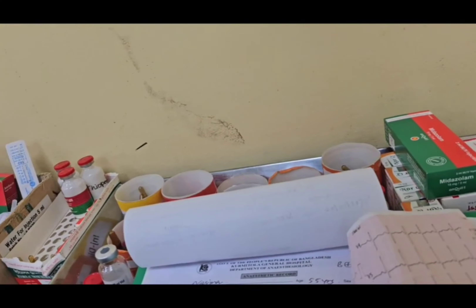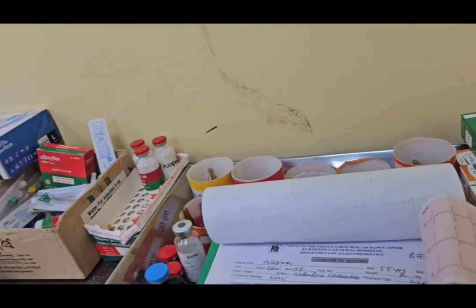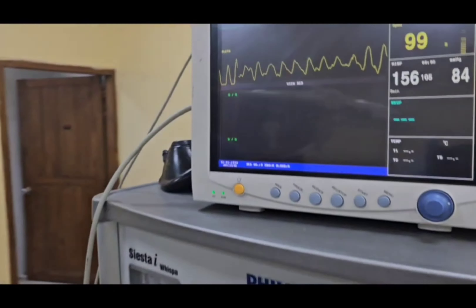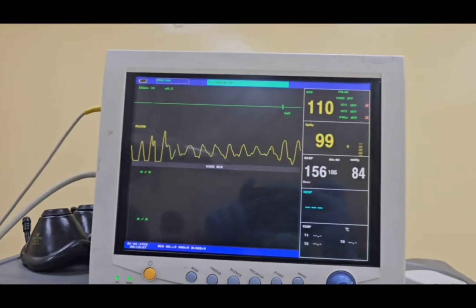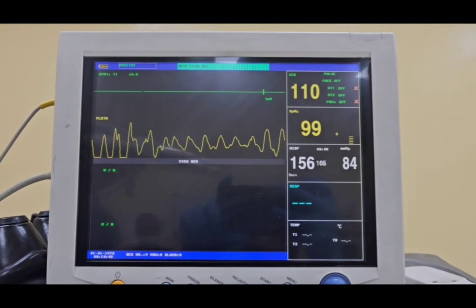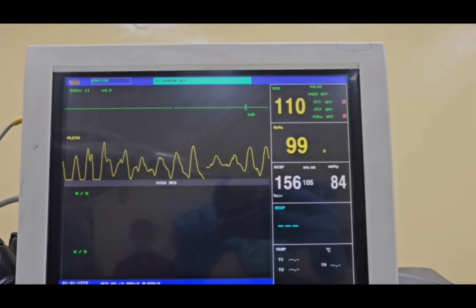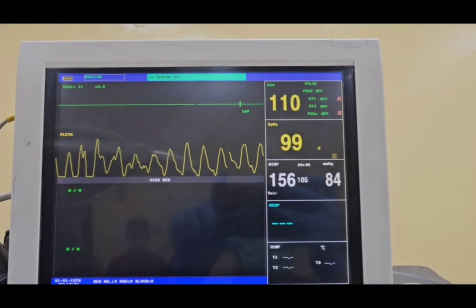At first we are checking the checklist. Then we are checking the monitor to see the vitals, if they are within the normal range or not.